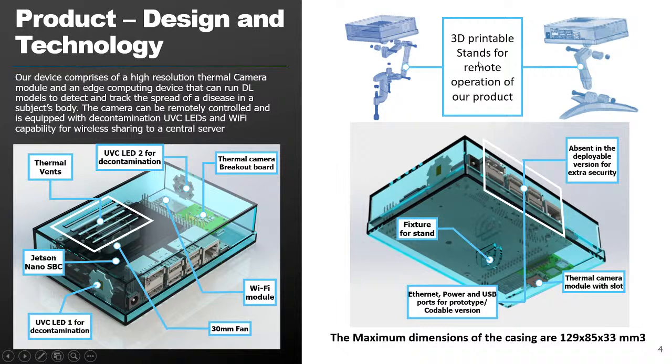The casing of our entire module is 3D printable, and we can easily produce one single set of required casing and stands in a single day per single 3D printing device.